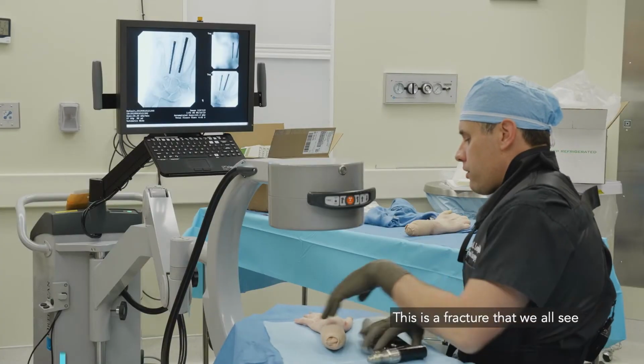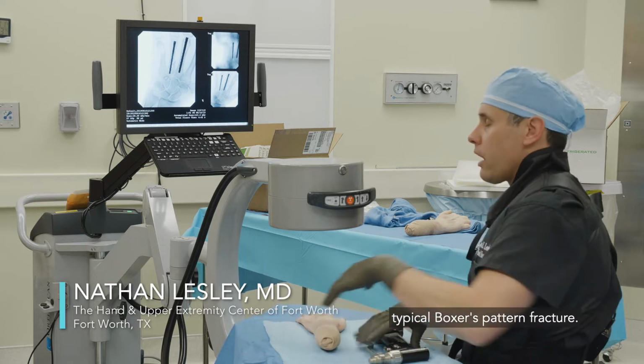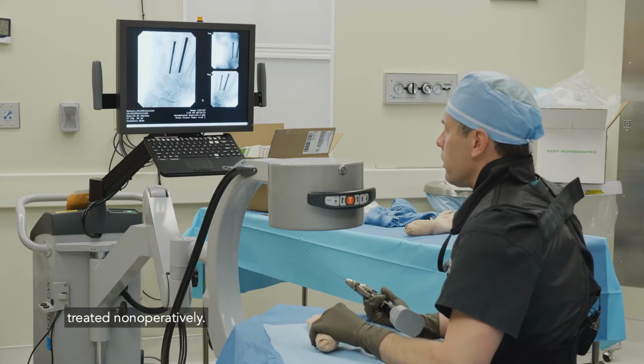All right, this is a fracture that we all see frequently. This is more of a typical boxer's pattern fracture, distal metacarpal neck of the fifth. Most of these are going to be treated non-operatively.